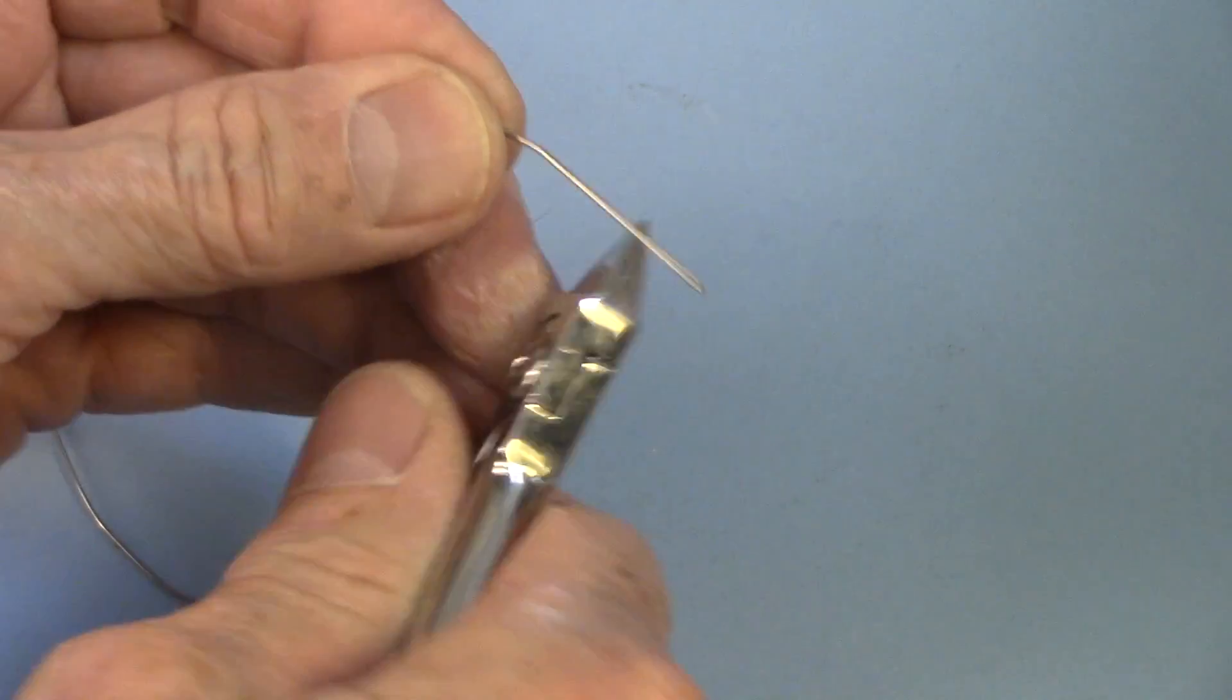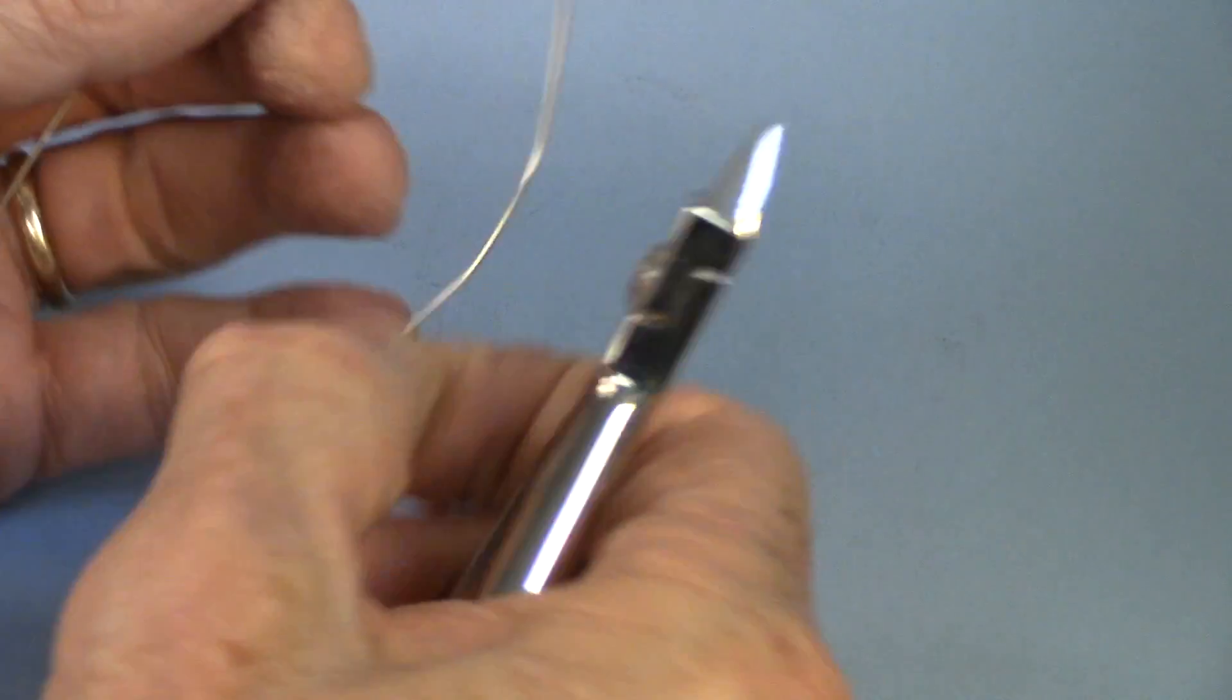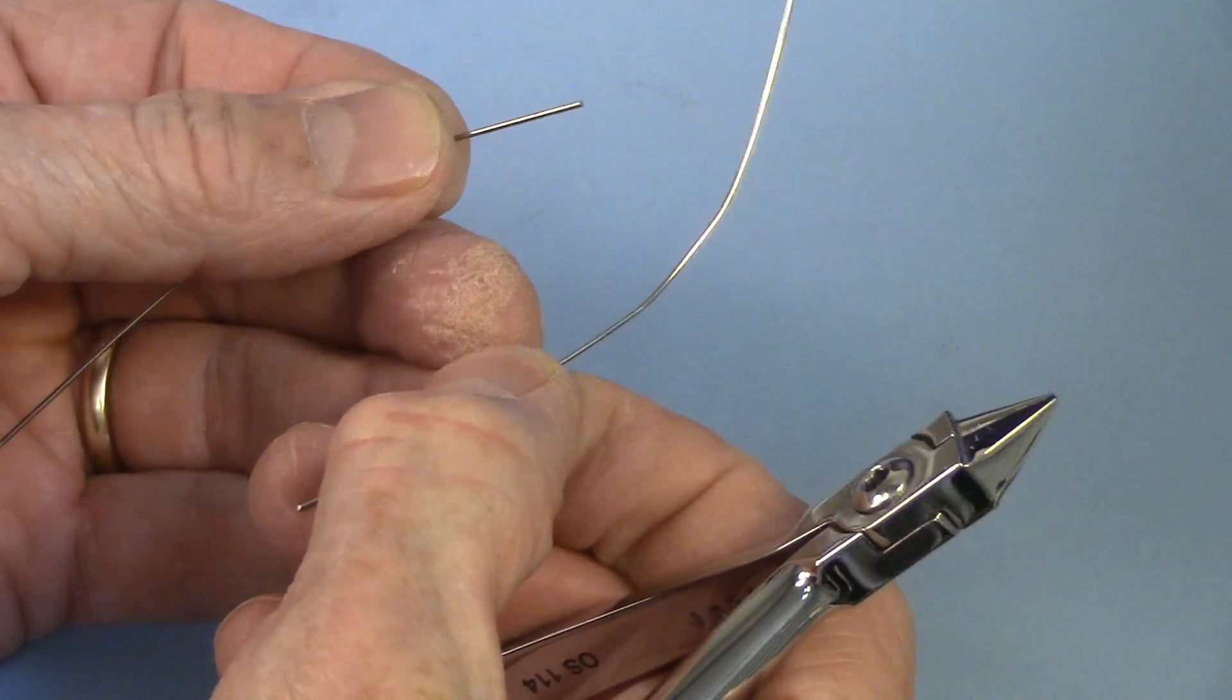So this wire doesn't have as much elasticity as this wire, even though this is a softer nickel-chromium wire. This is about as soft as the nickel-chromium wire as you can get, but it still is not as soft as the cobalt alloy wire.